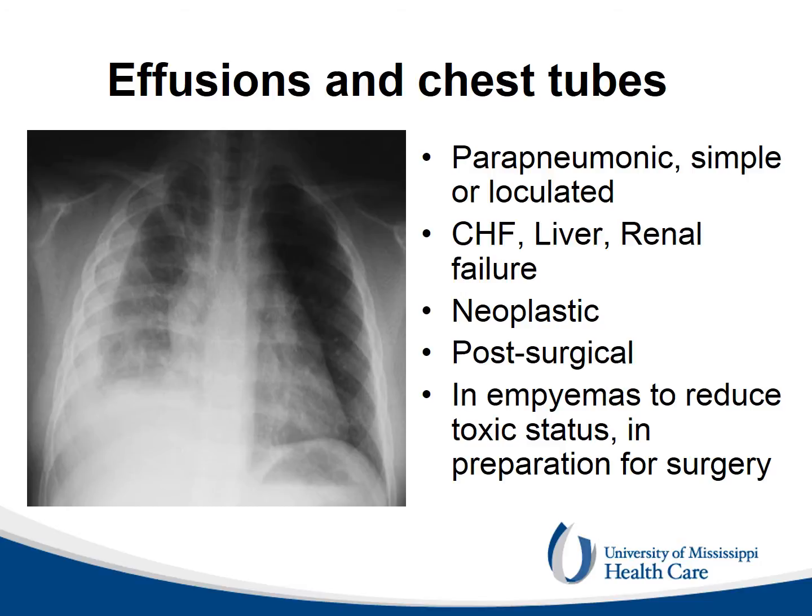Pleural effusions are the other common indication for the placement of a chest tube. Their nature can vary widely. It is important to decide if the amount of the fluid justifies the patient's symptoms and whether it indicates the necessity of a drainage.